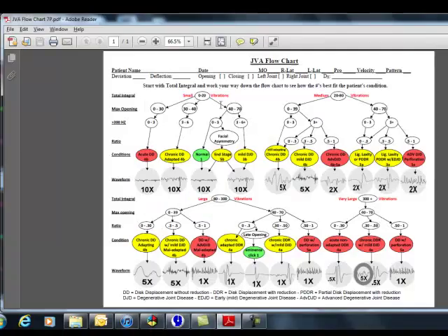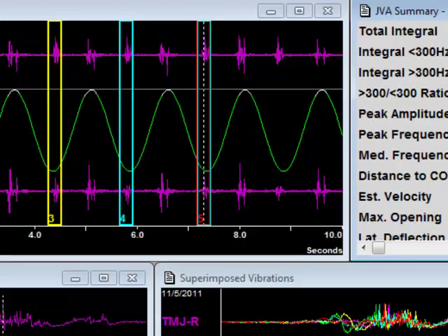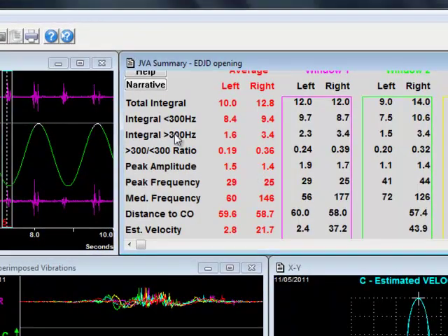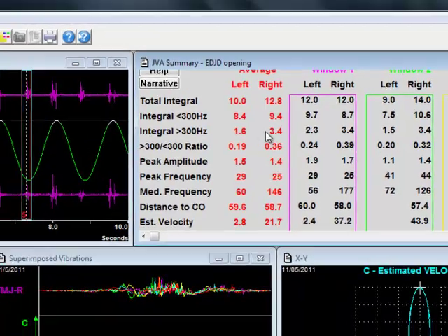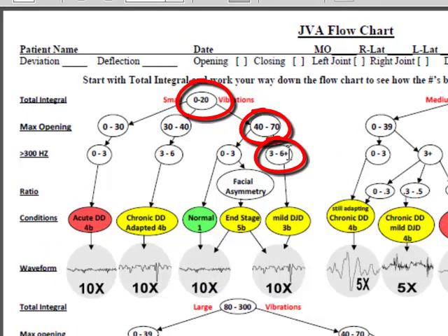We move to this bubble. The third thing we look at is our energy greater than 300 Hz. Looking at this, the energy greater than 300 Hz is 3.4, so then we move to this bubble.